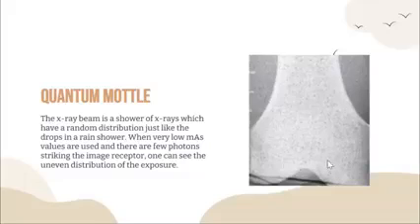So kung tutukan mo na siya, kung sa mga gubag mata, dili pa nila maklaro, pero pag tutukan mo, okay, the quantum mottle, the blotches, the freckles in the image is very apparent. Quantum mottle is a mottled appearance of the image caused by the quanta or photons in the X-ray beam. So mao to siya quantum mottle, it's because of the quanta or the photons, X-ray photons striking the image receptor. Visible mottling of the image indicates that an insufficient amount of X-rays have reached the image receptor plate.